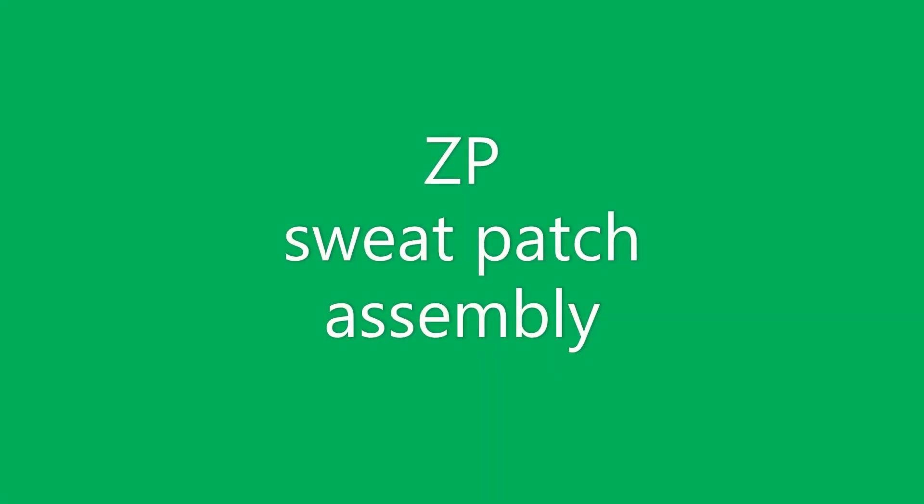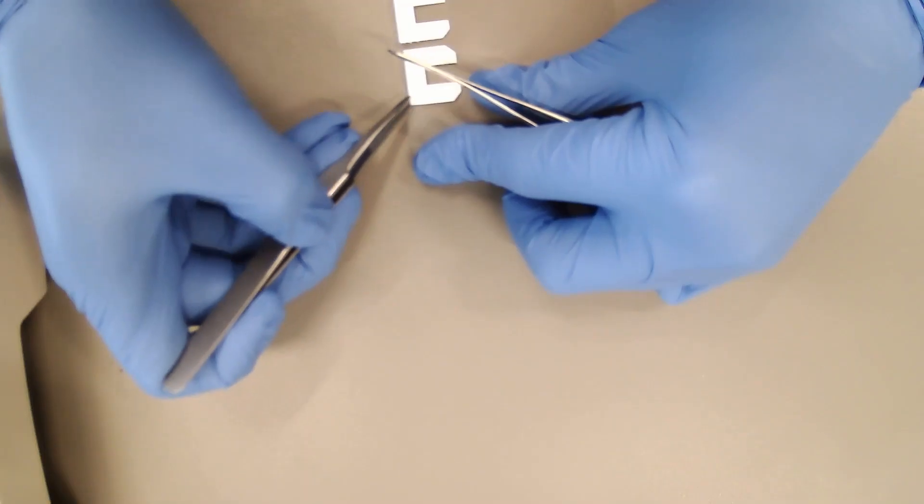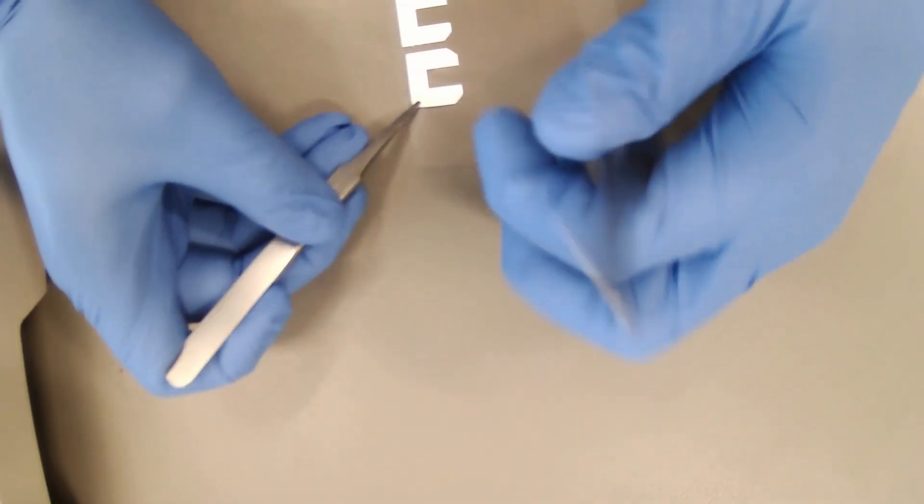In this video we will show you how to assemble a microfluidic patch from Zimmer and Peacock. We will build the patch layer by layer and the only tools you need are tweezers.